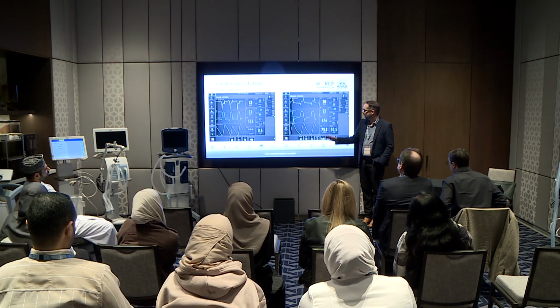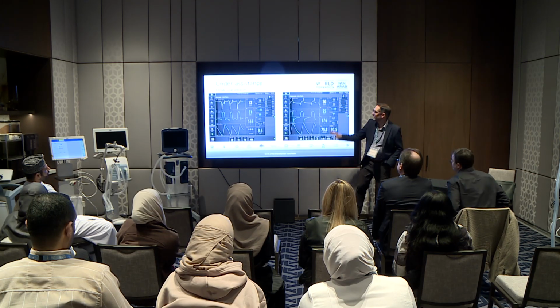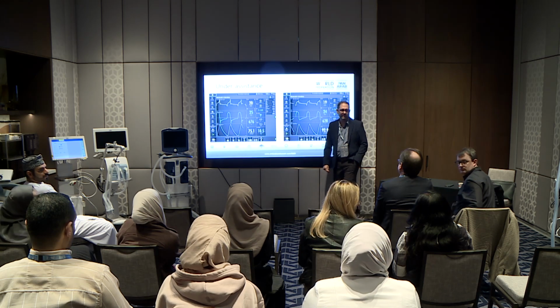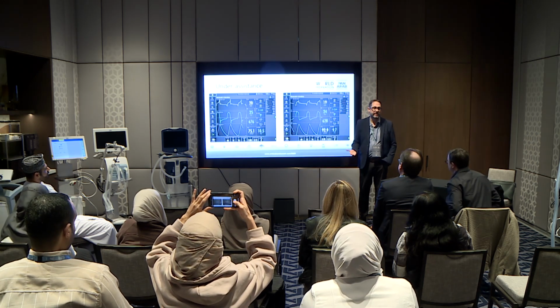Okay. Now, what can you tell me? I'm just going to take this picture and move it over there. ARDS case, yes, it was. Yes, so the volume is very high now, we don't need to. Yes, they're breathing spontaneously though.